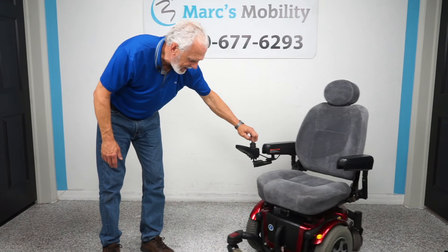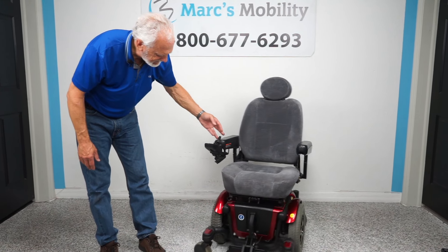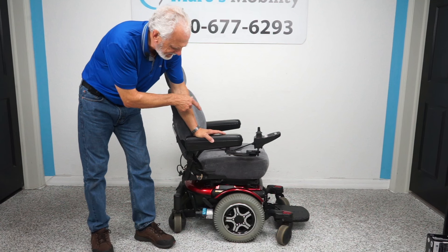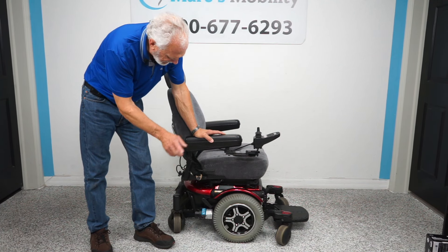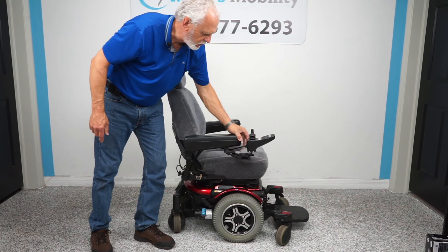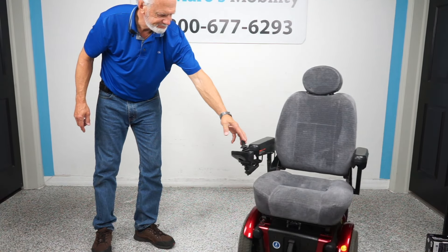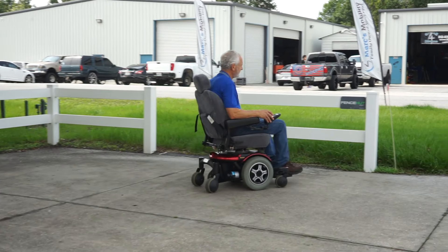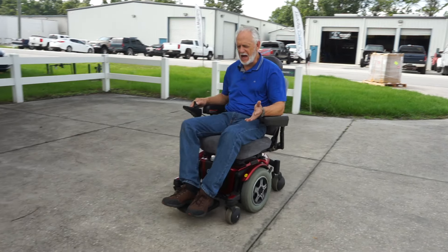You can see it's in excellent condition and it runs super. This is a Quantum 600e with a captain cloth seat, solid tires all the way around, good motors, adjustable arms, flip-up foot plate, swing-away joystick — and this one is ready to go right now. Top speed is about five miles an hour.